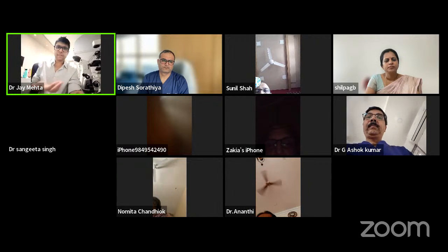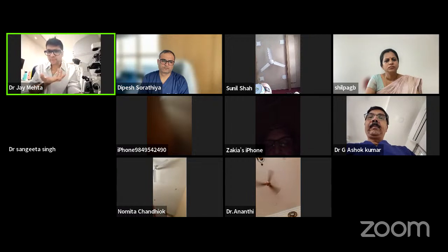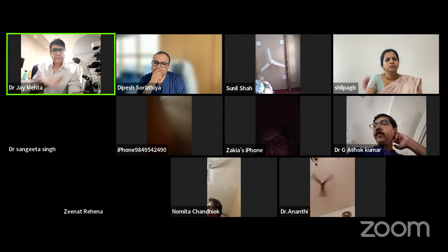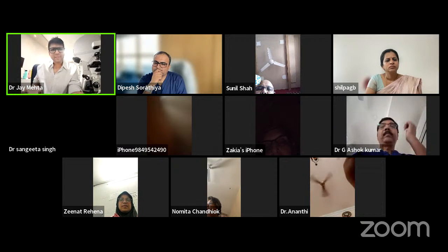You should go to the patient and show them the embryos on time lapse. In my laboratory, it happens very commonly. Every month I will go and tell 5 to 7 patients, I'm so sorry, you did not form correct embryos. There should be no shame in that, because the patient is going to happily accept it. As long as you are giving the video of the embryo which got arrested, the patient will accept it.